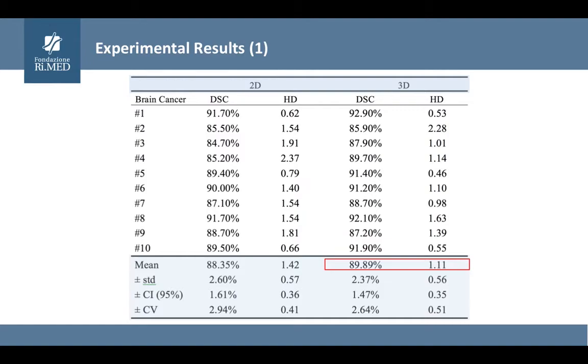To assess the performance of the implemented 3D system, 10 clinical cases of oncology patients with brain metastasis were considered. We compared the gold standard with the contour obtained by intersecting the active surface with the planes defined by the PET slices. For each clinical case, we computed the score and the Hausdorff distance, and we compared them with the corresponding result of the previous study.